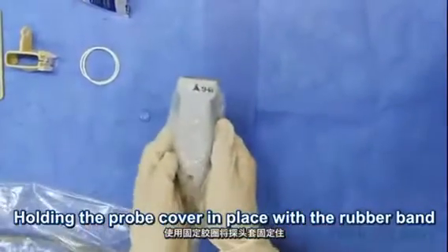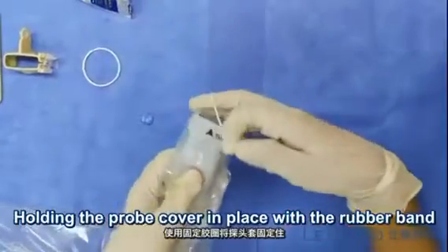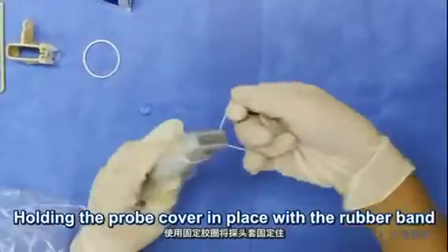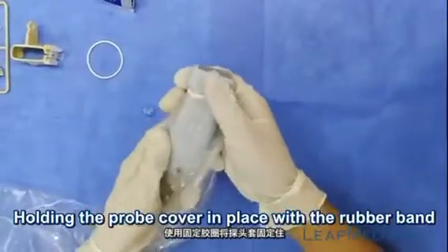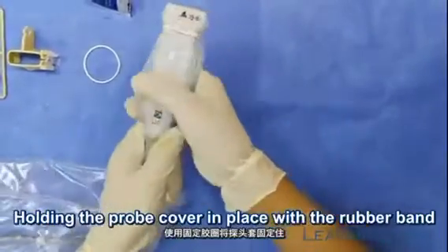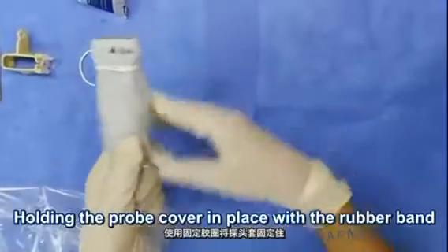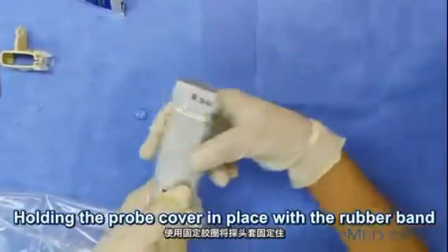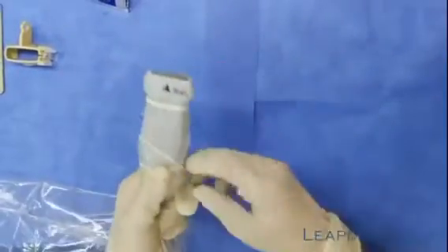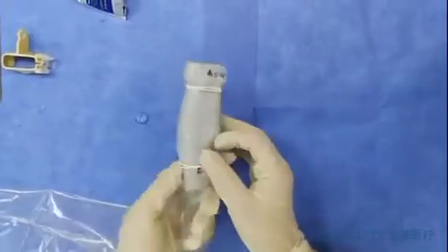Eliminate the air and hold the probe cover in place with the rubber band.